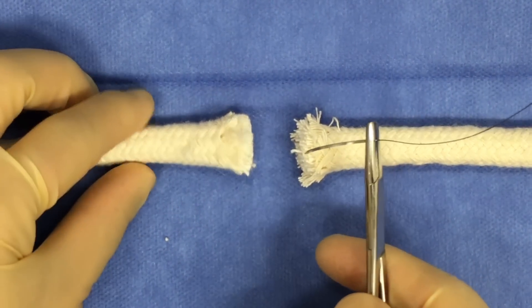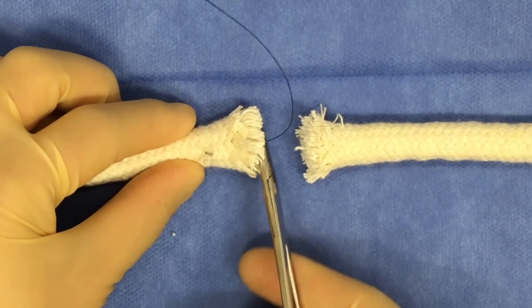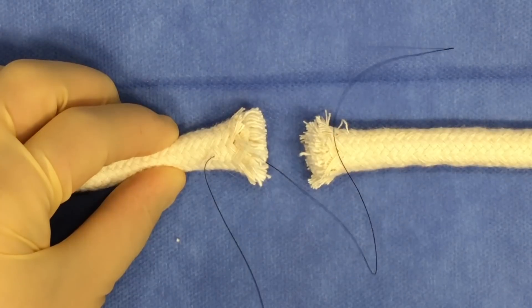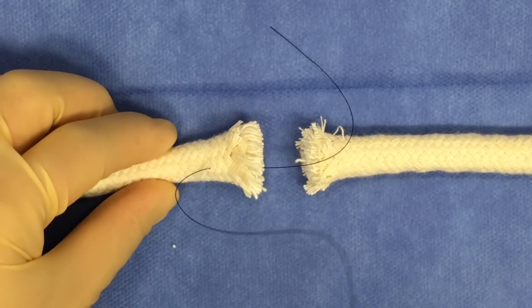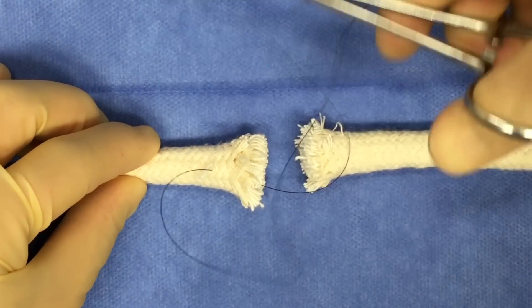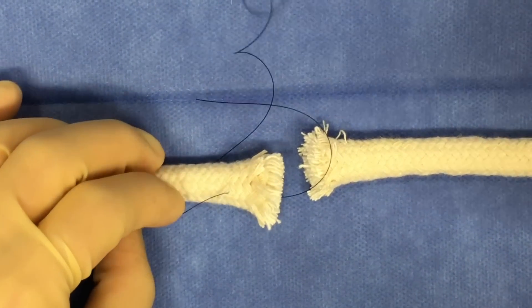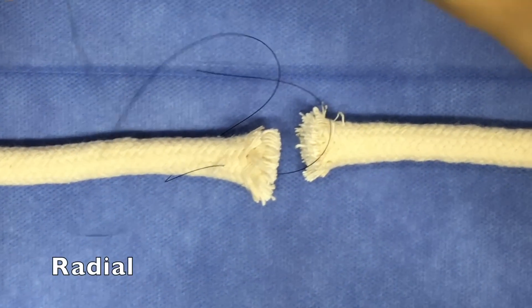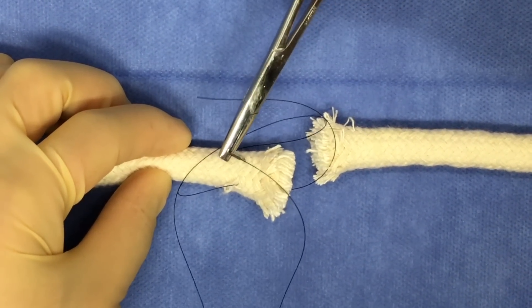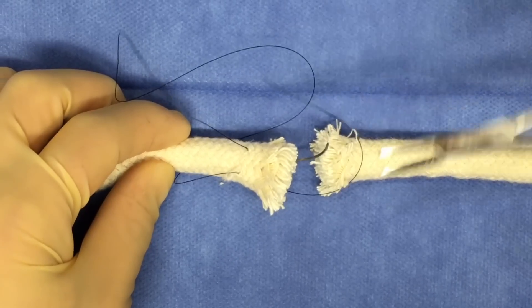You begin with the two ends of your lacerated tendon. Now assuming this is a tendon that's rounded in shape — for a flat tendon you might simply apply a horizontal mattress suture. Your first throw of the suture will be intratendinous through the lacerated end of the tendon and will exit through the dorsal surface of the tendon. You'll typically pick either the radial or ulnar side to throw the first suture. You're then going to pass the suture behind the tendon, ventrally to the tendon, so that you can enter for your next throw, keeping the horizontal mattress suture pattern.